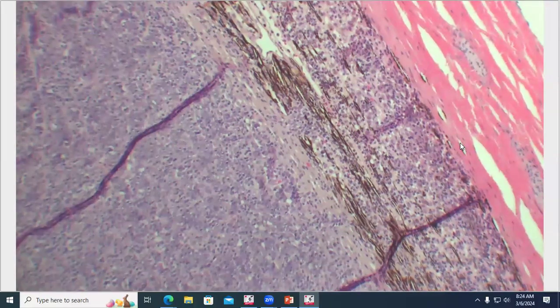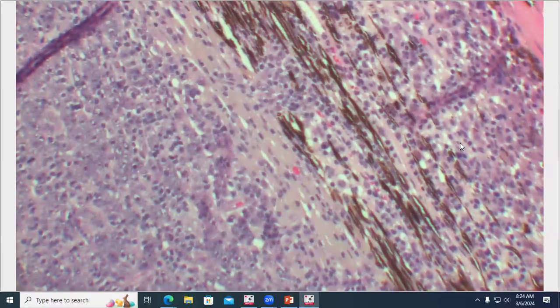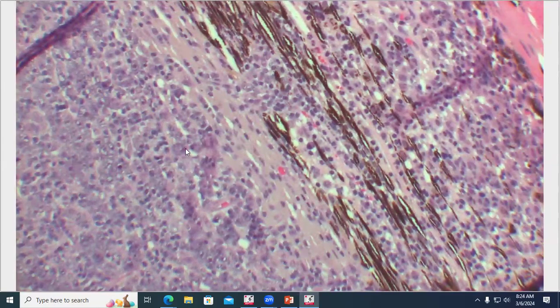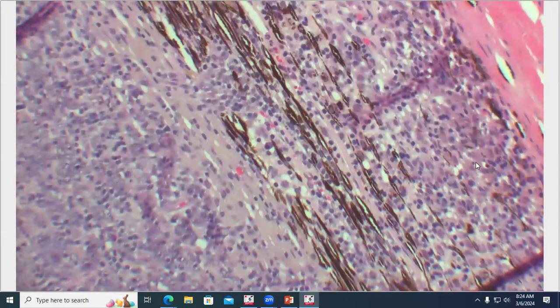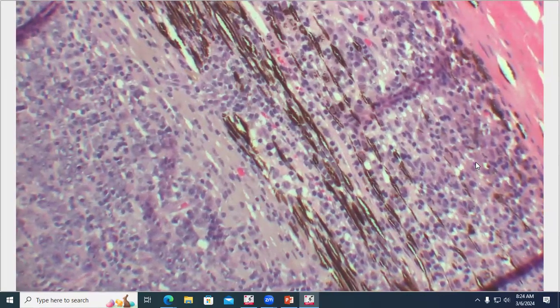So we can see this cellular infiltrate of round cells. And if we take a look in the choroid, we can see a lot of round cells in here too, a little bit smaller than these bigger ones out here. So these are more of our lymphocytes and plasma cells, pretty typical of a lymphoplasmacytic, in this case, pan-uveitis. You could still identify some of these cells in the iris and ciliary body, but back here in the choroid, they looked really good.